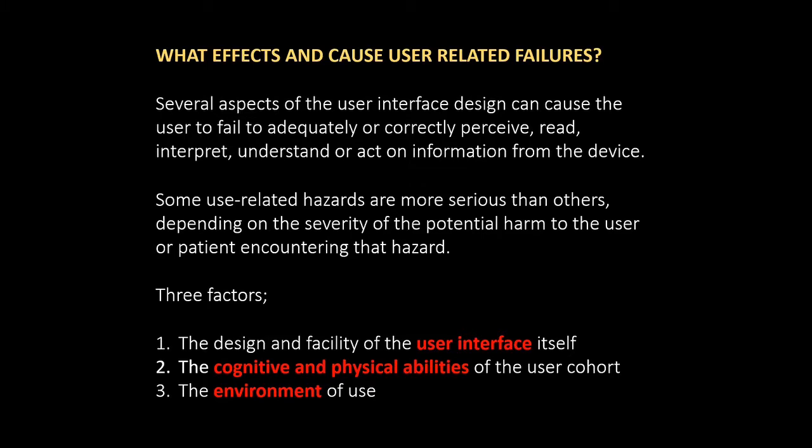That's the design of the interface itself, which we'll get onto in a little bit, where we're going to be talking more about the graphical user interface. But I want to draw the larger picture that the user interface is not simply the graphical user interface, it's also a whole range of other things. We've got to consider the cognitive and physical abilities of the user cohort: age, status, sex, gender, what their previous experience is, how they relate to technology, and so on. And also what the environment of use is.